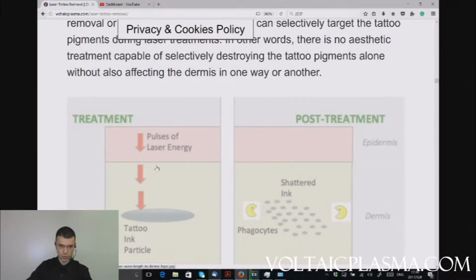And this is another picture showing you, it's not the exact model, just to give you a rough idea of how the laser tattoo removal process works. Fading is a better word than removal, because every time you go through a laser treatment, the tattoo is faded, it's not removed, unfortunately. Sometimes you can remove them within one treatment, but you get the scar immediately after the area has healed, so you get a trade-off. But this is the basic gist of it.